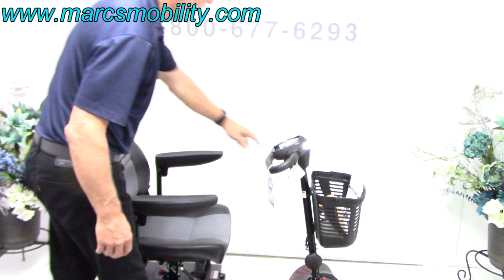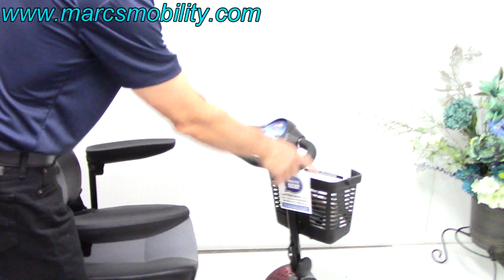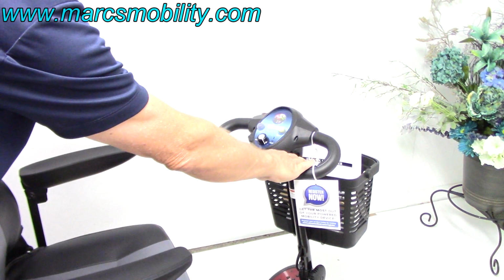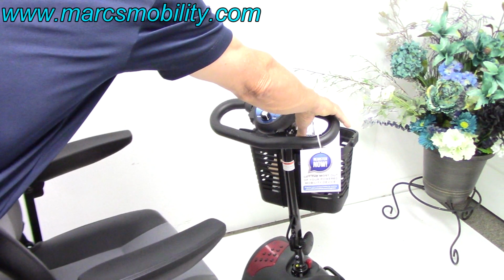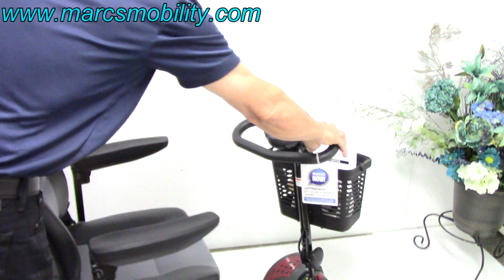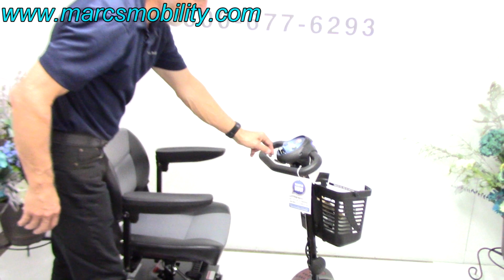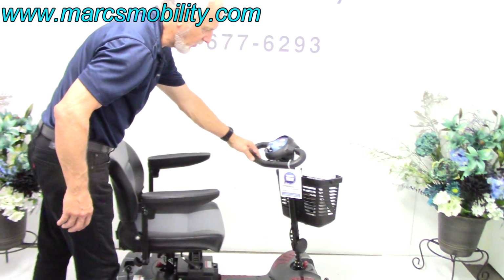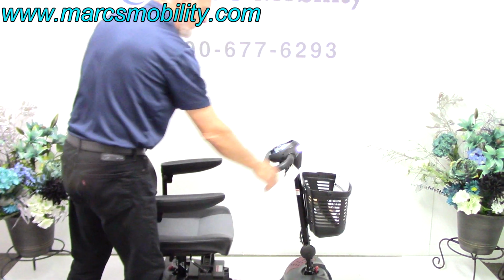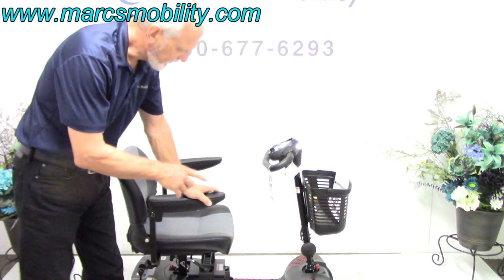The nice thing about this scooter, when you drive this scooter, this is called a delta tiller. If you only have one hand, you could make it go forward here, and you can also go reverse on the same side. Forward and reverse. Of course, you can do the same thing here. Forward and reverse. So you can drive it with one hand on one side. Okay? This is a 4-wheel scooter.